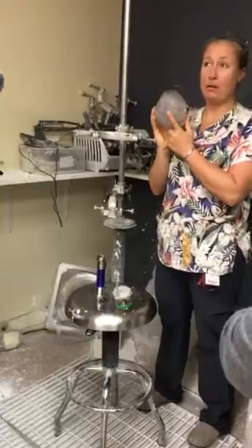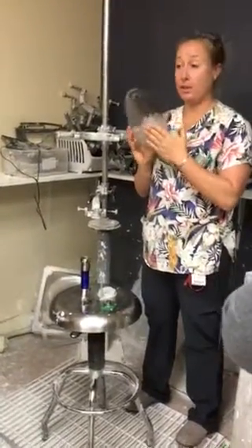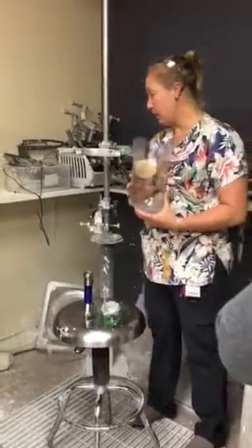First thing: rough up the bottom of your socket so that the adhesive will stick. Don't forget to do that. If you get everything set up and then realize you didn't rough it up, you'll have to take it all out and redo it. So do that first.